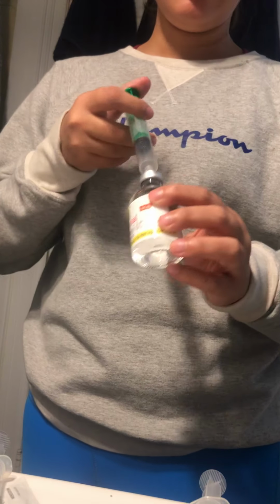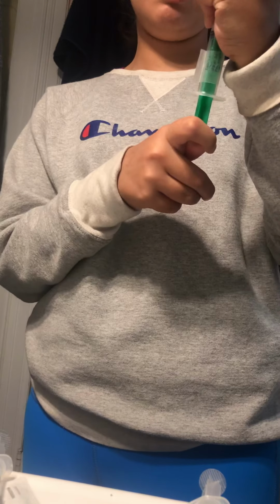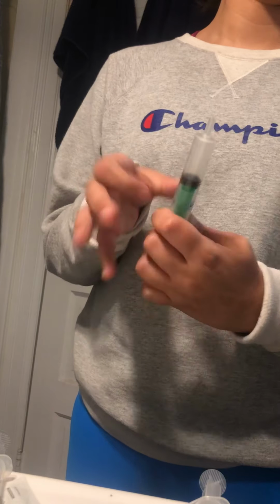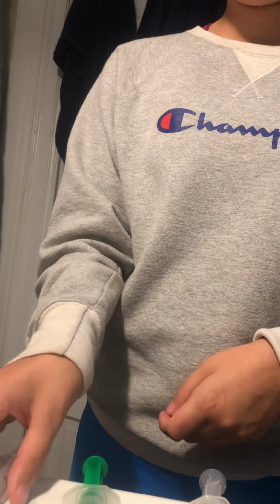Inject it. Flip it. Get the 2 milliliters. Make sure there's no bubbles. Flick it. Okay, there's no air bubbles.